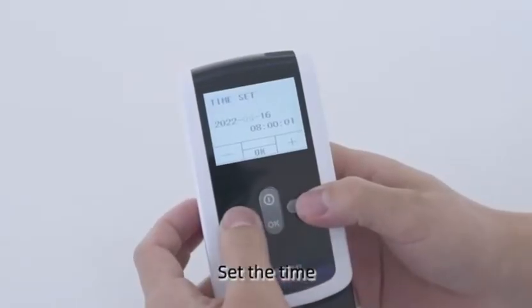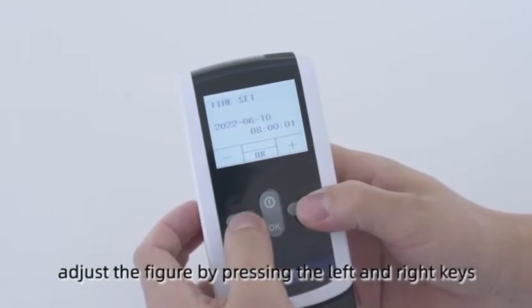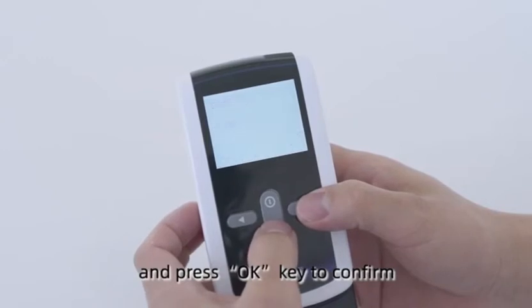Set the time. Adjust the figure by pressing the left and right keys, and press the OK key to confirm.